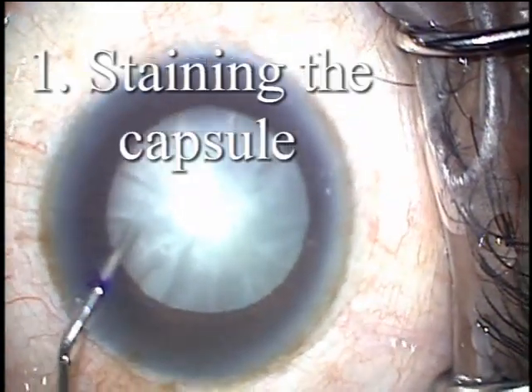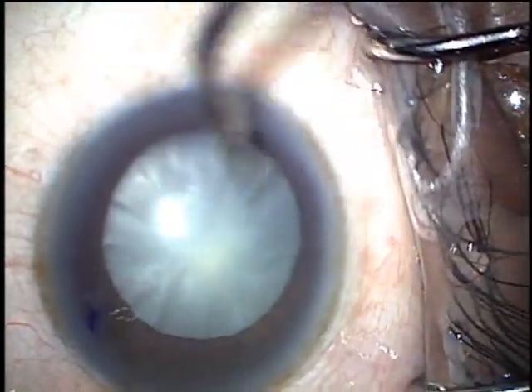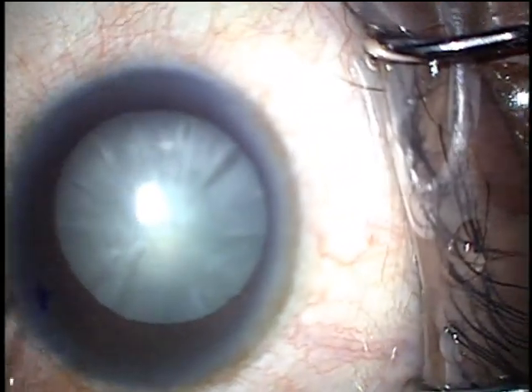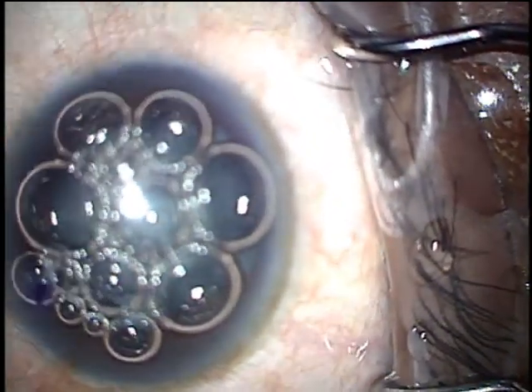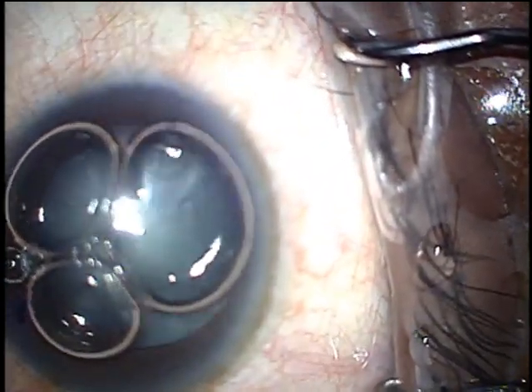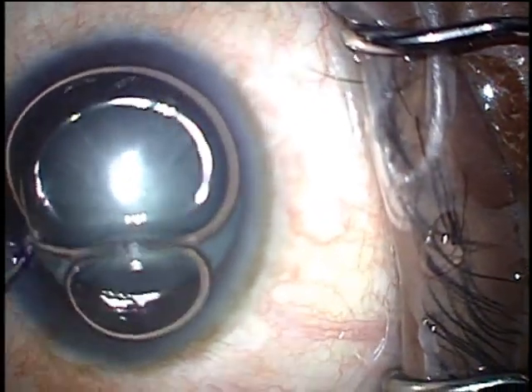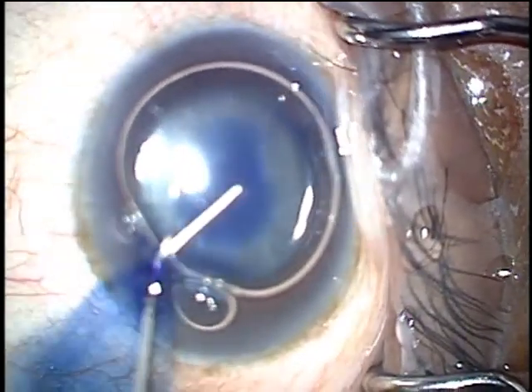The key thing, as with any white cataract, is to first stain the capsule. I like to inject under air with a separate air syringe and then I pull back on the syringe with the VisiBlue so that I'm injecting air first, maintaining my air bubble. This way I keep the corneal endothelium from being stained.